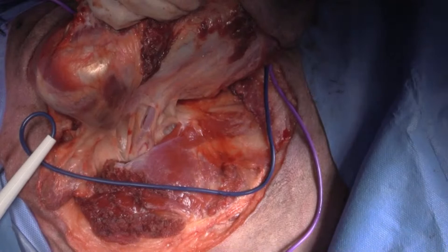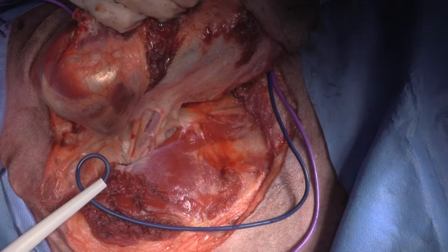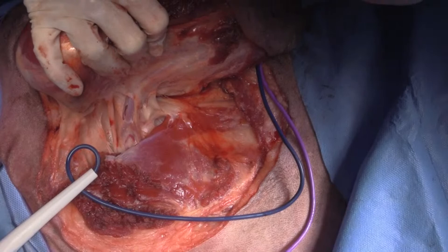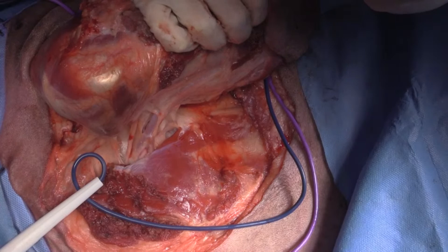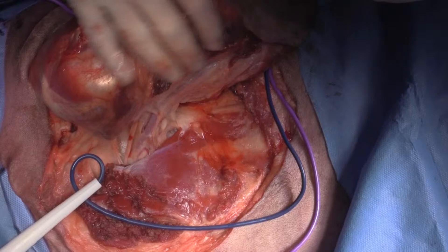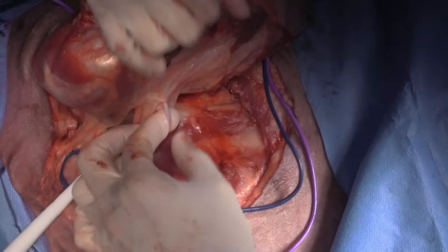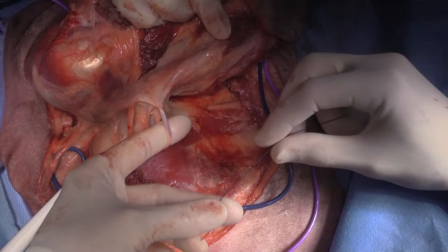I'll take a 22 first — gray needle first. Do you have it drawn up already? Yeah, okay, just squirt it in there. We're getting our mepivacaine injected up here. So the trick with the vessel: put your finger through, grab onto the suture with your middle finger and thumb, wrap it around your finger twice, then pull it through.